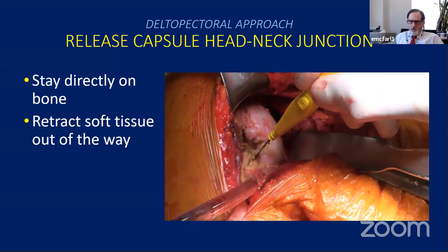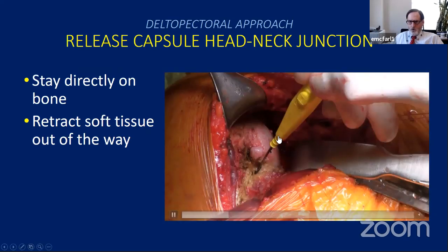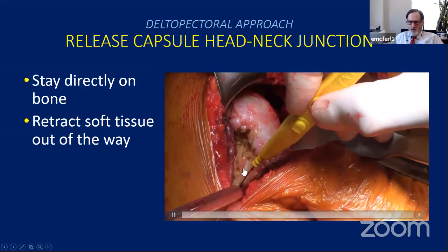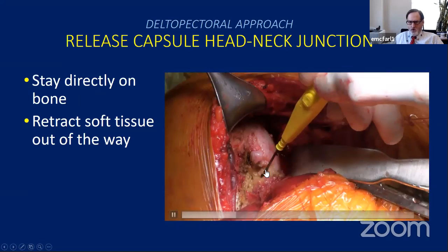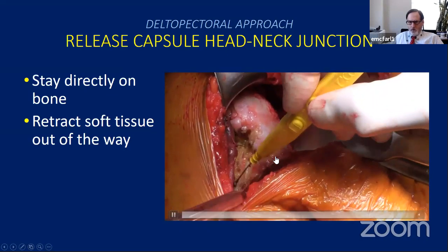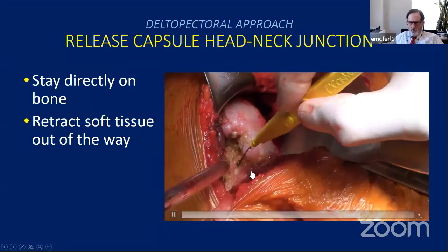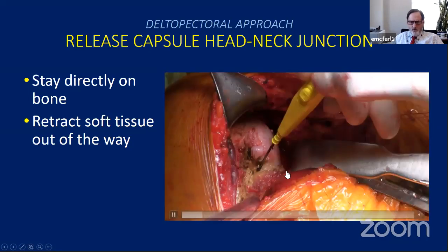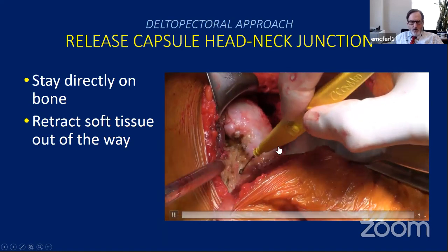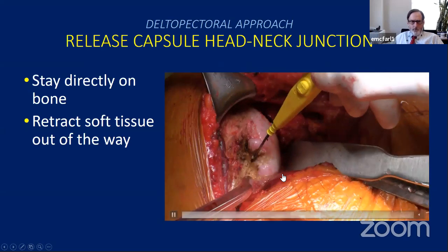So the next thing you're going to do is release the capsule at the head neck junction like this. You can see here's a better view of what you do when there's an osteophyte. You want to keep a retractor here, but if you stay on bone and go along the medial aspect of the head neck junction, you can release the capsule pretty safely up underneath the osteophyte. I usually keep a little instrument down here to protect the axillary nerve. If nothing else, I use a pickup to do it, but a smooth retractor down here is also very helpful. So again, the axillary nerve is down here somewhere.